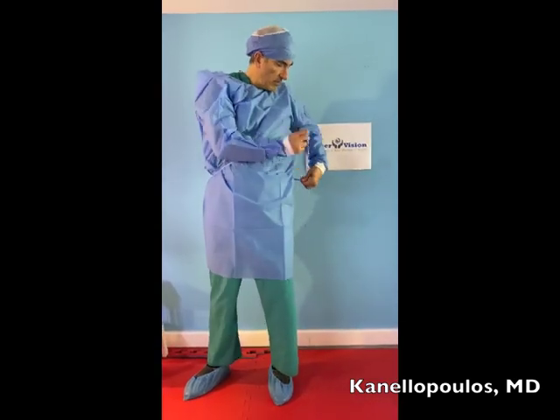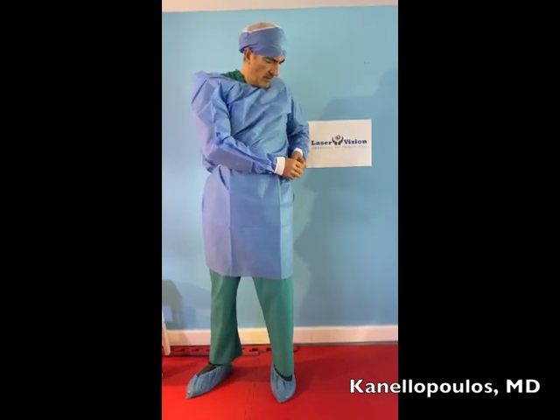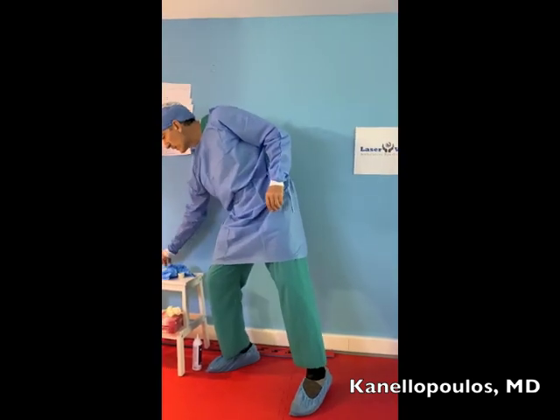So here I am, I have my gown on. I will put my mask on, and this is probably the most important part that I want to share with you.